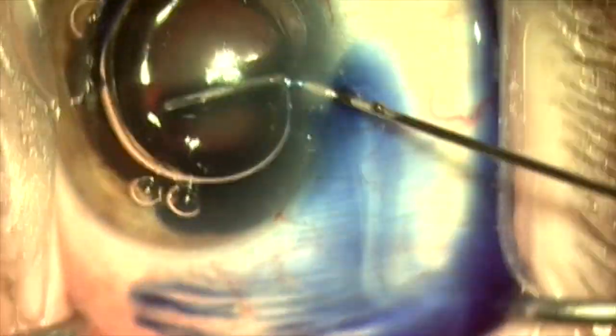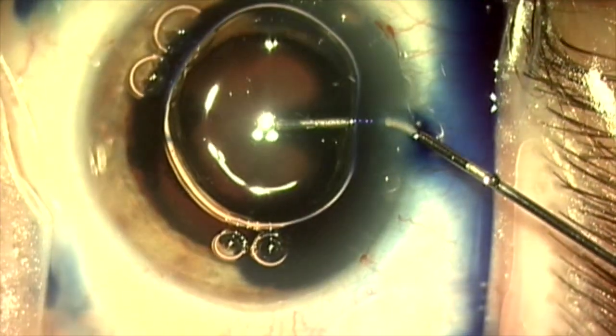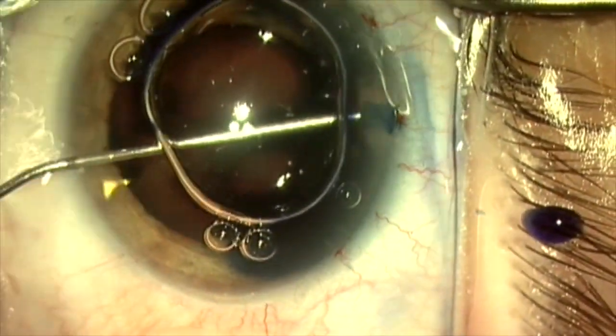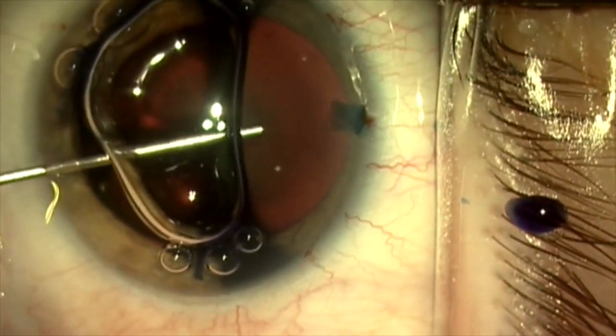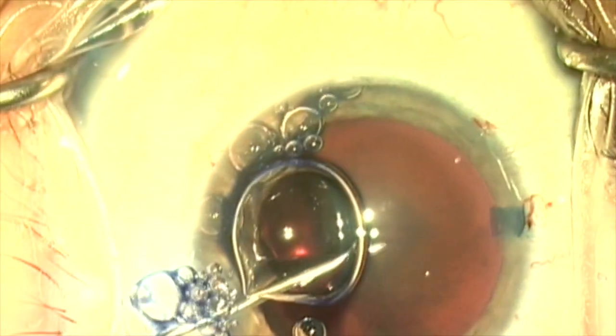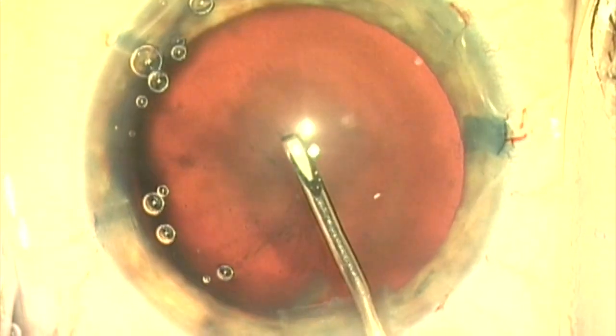Here I'm drizzling a little Trypan Blue on the anterior lens capsule, and that viscoelastic that I put in there will serve as a barrier to prevent it from ruining my red reflex. Now we're going to displace the Trypan Blue with viscoelastic using a soft-shell technique.